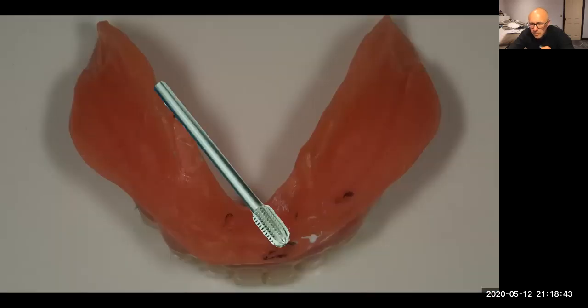If we're using Moloplast or a soft lining material, then proper burrs are needed. This is a Moloplast trimming burr. They've got a different shape to them, and they can cut the silicone really well.